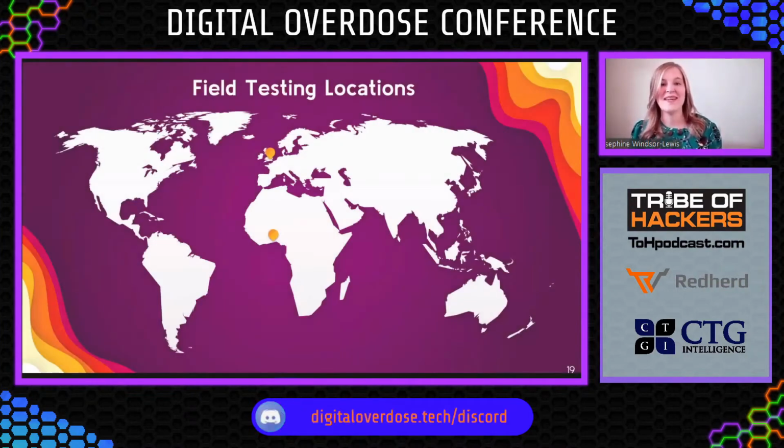Let's talk about the testing we're doing currently. We are testing in 2 locations. We have tests ongoing in the UK, that's in UCLH, and tests going on in Accra in Ghana. These tests are currently taking place in hospitals because we need to be able to compare the results that we're getting to blood tests. That's the gold standard I mentioned earlier, to see how accurately we are able to predict the bilirubin levels in blood.